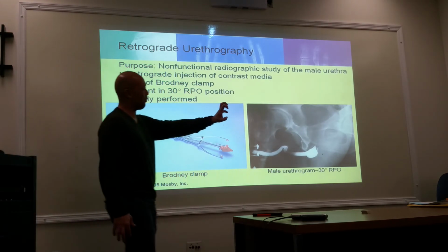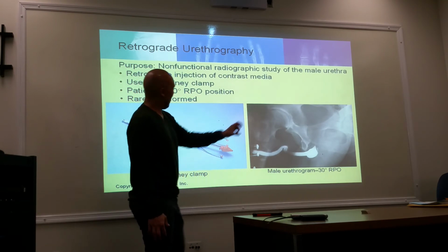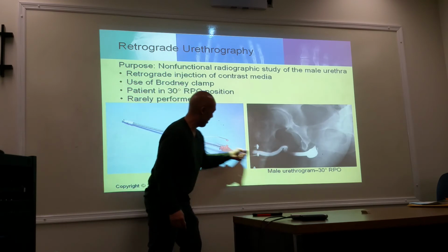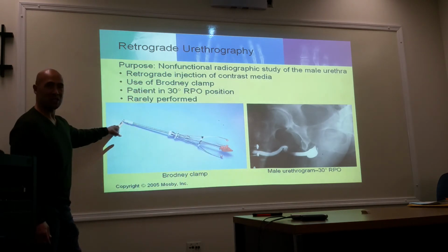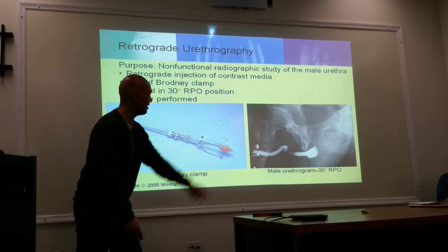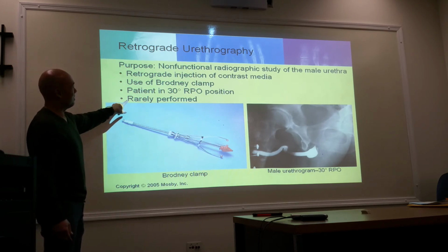It grabs the head of the penis, and then you have this tube that's inserted into the urethra. They will inject the contrast or drip or infuse the contrast into the urethra. So again, rarely performed.